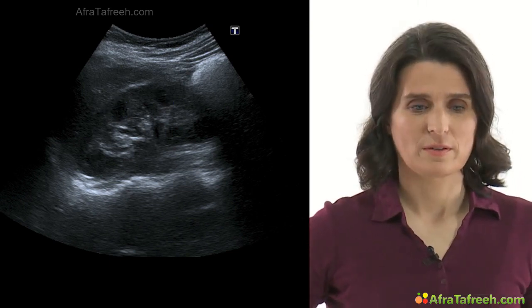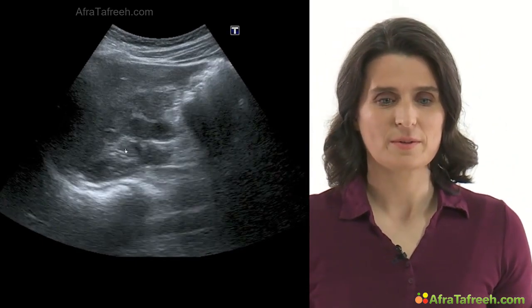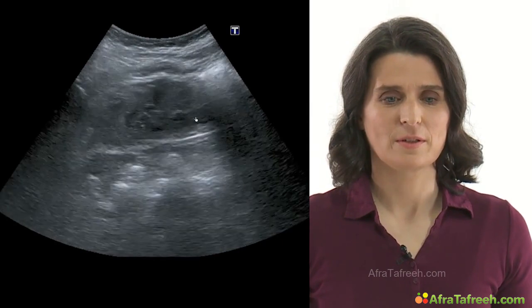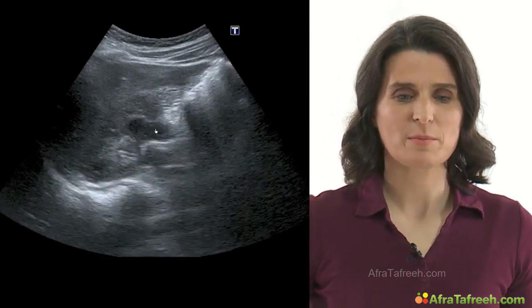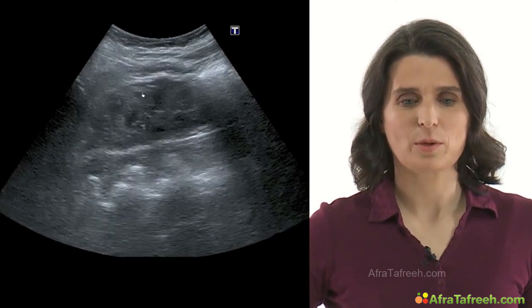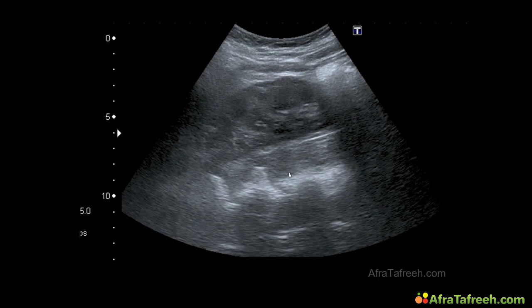Now we've got a video clip of a scan of the right kidney, longitudinal plane. Again, we can see the bright pelvis in the middle and the parenchyma with its medullary pyramids over here. In this structure, dorsal of the right kidney is the psoas muscle.